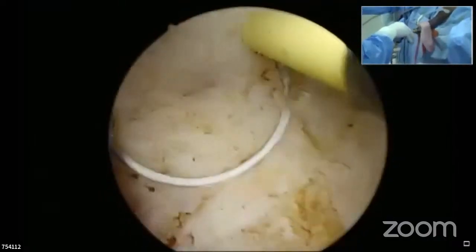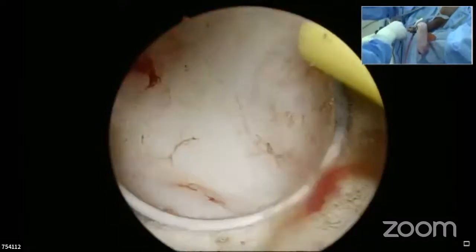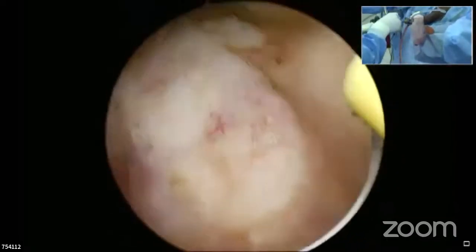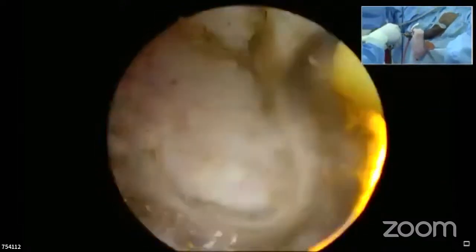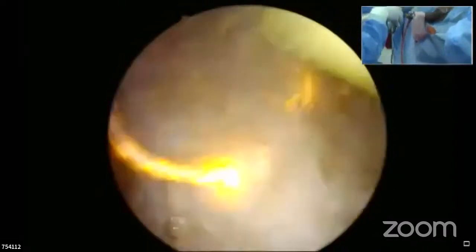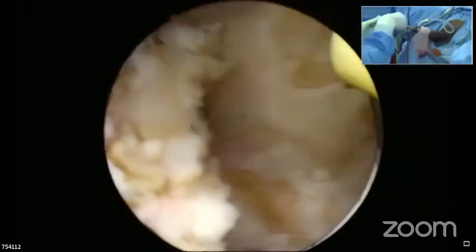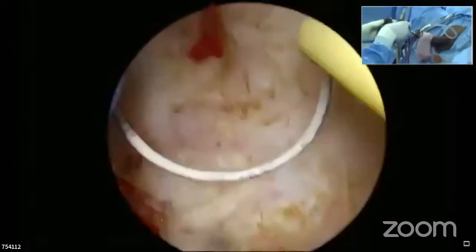One question: reverse cutting at the apex. No, I don't like to do any reverse cutting at the apex. What he's doing at the apex is the right way to do it. No, but I make a reverse cut because I identify up to what level I have to come, and from there I make one cut in reverse. And that works very well in my hand. So that identifies the site. I don't have to come forward cutting. I do backward cutting there.